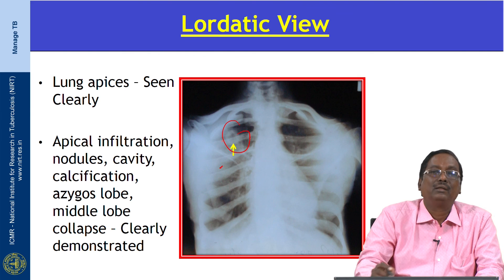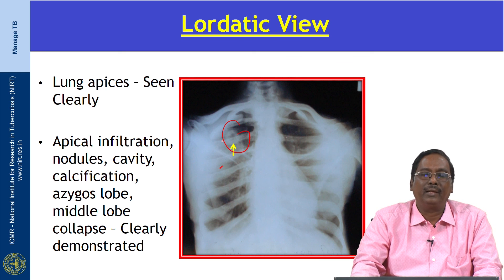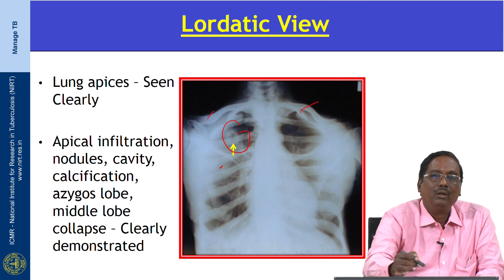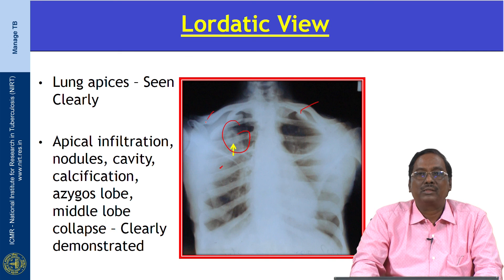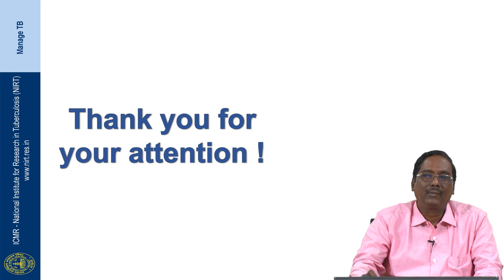A cavity in the apical area is clearly seen in a lordotic view because this small area is covered by the clavicle and ribs in a standard view. By positioning in the lordotic view, the clavicles are shifted superiorly, allowing you to clearly see the apical area. With this, we are finishing the interpretation of the normal chest X-ray.